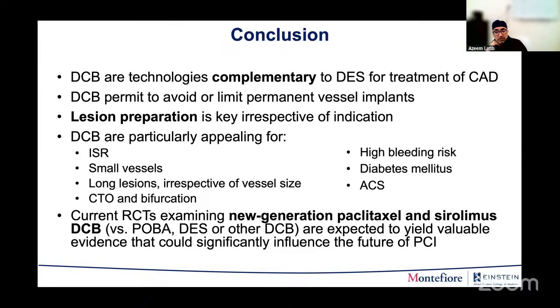So I would suggest that we actually start doing it, but in a very controlled way, where we actually collect data. The good thing about that group of patients, they come back for routine angiography, right? So you're going to get angiographic follow-up in all those patients. We have a large transplant population at Monty. We have an amazing interventional group who does imaging. To me, this is a great clinical study that we should study internally.